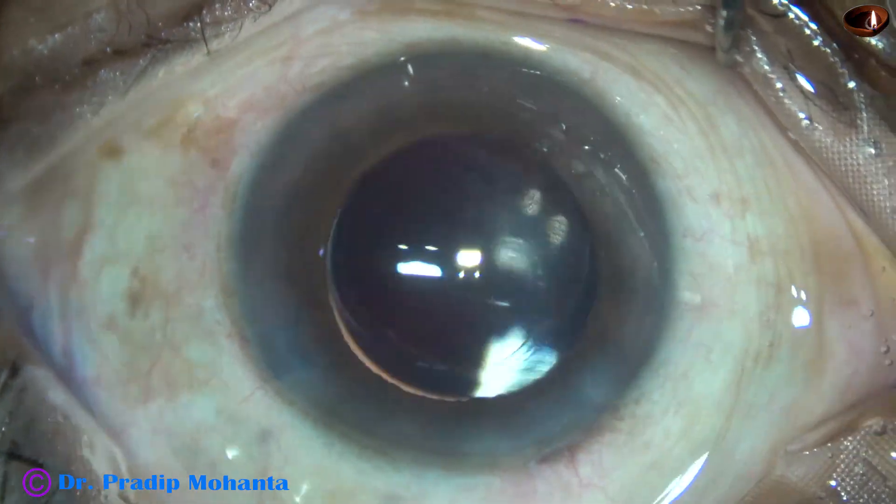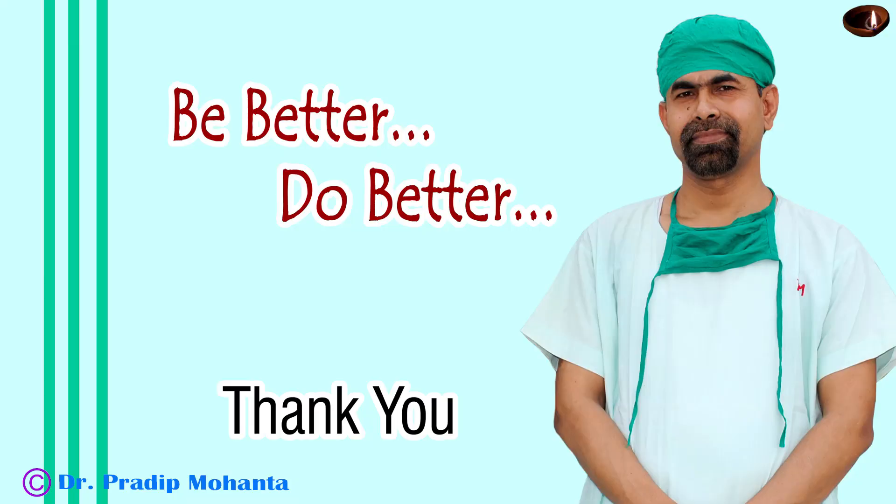The anterior chamber is nicely formed and the case is concluded. Thank you very much for your attention. Hope this video will help you in developing your surgical skills. Be a great surgeon and serve your patients with love, respect, empathy, and great surgical competence.